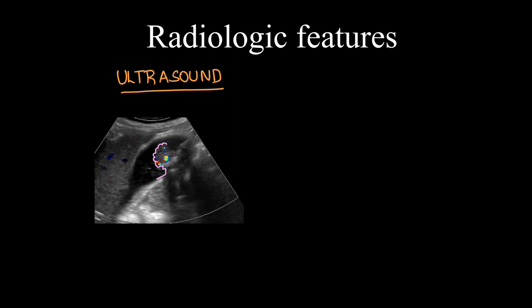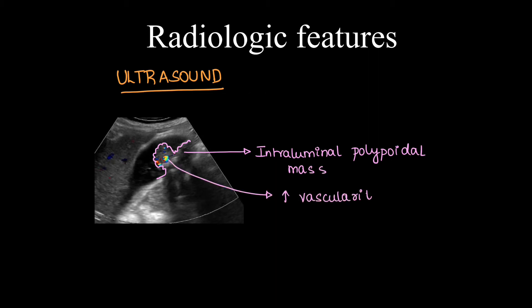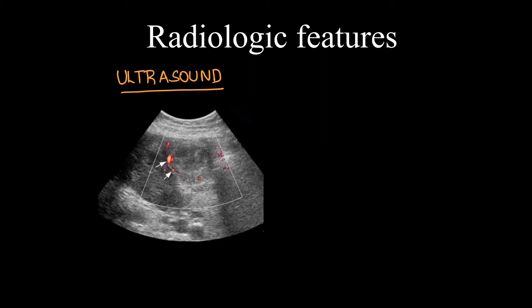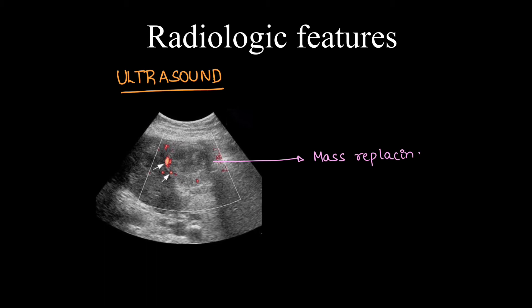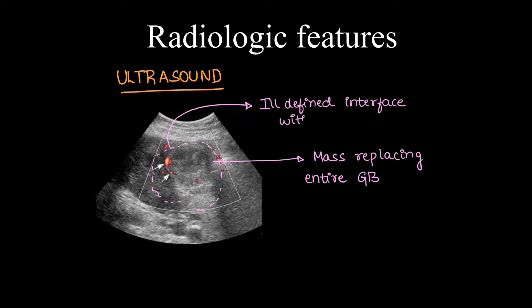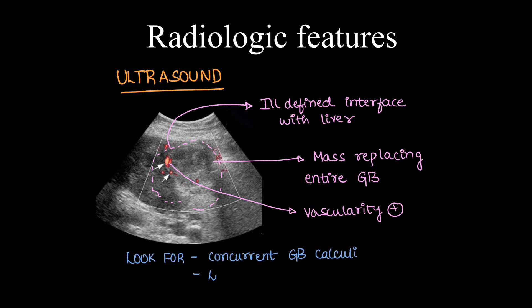Coming to ultrasound findings: here we can see a polypoid intraluminal mass type of gallbladder carcinoma showing foci of internal vascularity on color Doppler. The next type shows an ill-defined mass replacing the entire gallbladder with ill-defined interface with the liver, also with vascularity. You should look for concurrent stones in the gallbladder and perform liver screening.